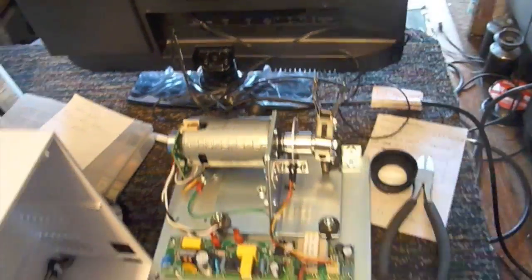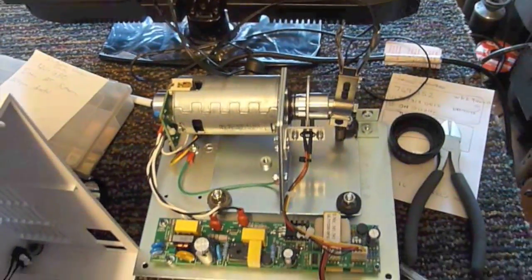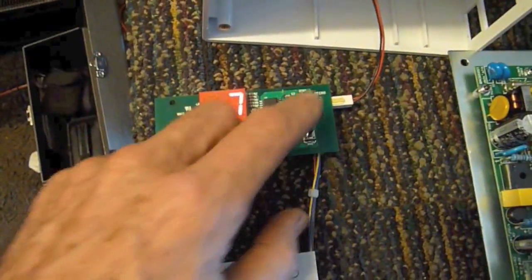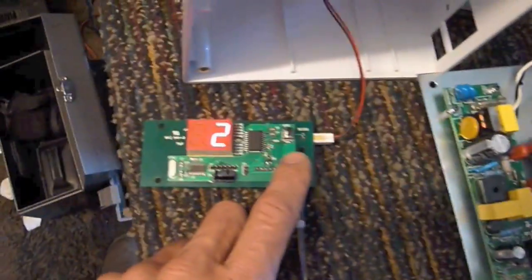Anyway, just kidding. There's a lot of debate as to whether amalgam's so terrible or not. This thing came in here intermittent. You'd push the start button, and it's got a timer here that you set for however many seconds you want, and it counts down, and this thing shakes it for so many seconds.